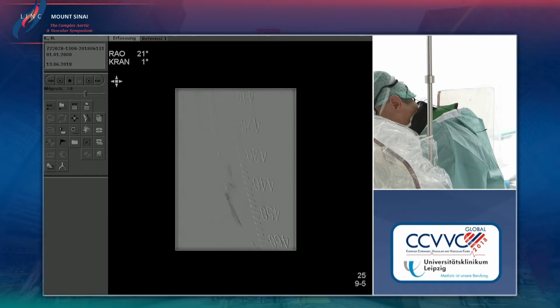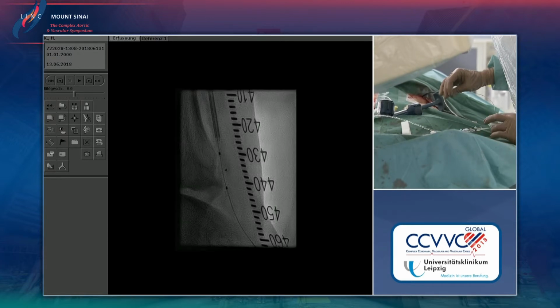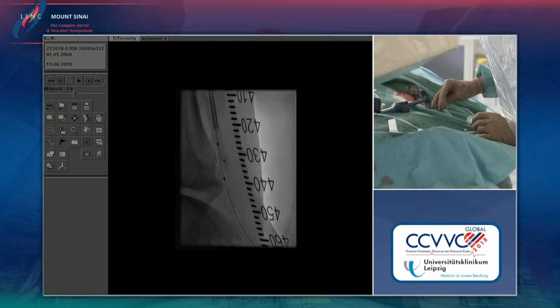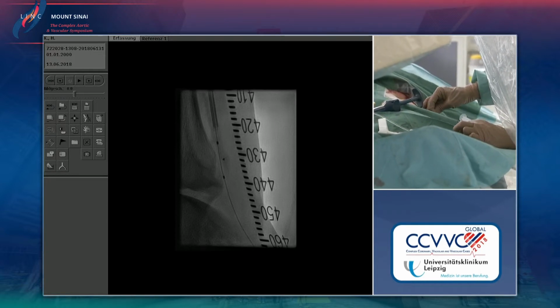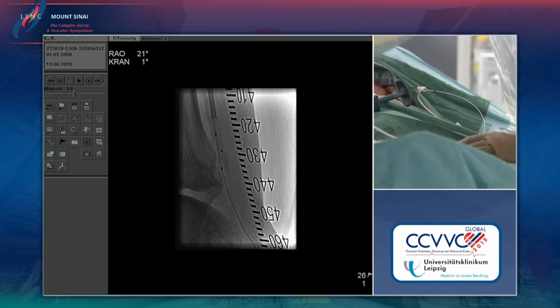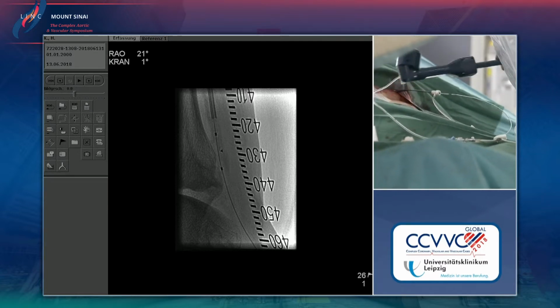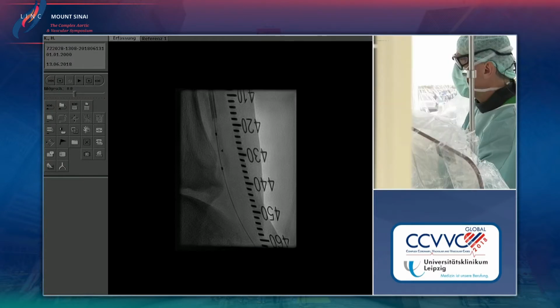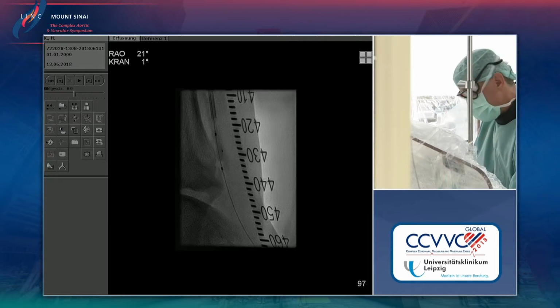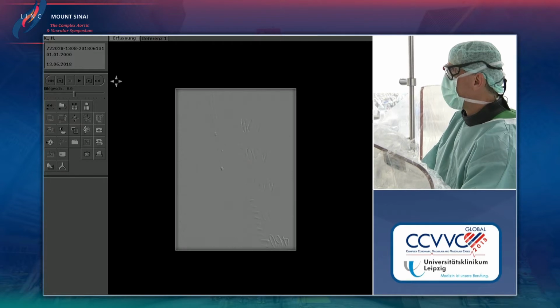Really just to deflate and turn it around a little bit? Sorry? Said probably deflation and then torquing the catheter a slight bit. Yeah, I can try to torque it. I can try to maybe go a little higher to see whether there's some area with less calcification, but I think there is even more calcium. You can only try once again here. This device will help non-surgeons understand how painful it is to do a distal anastomosis sometimes. Everywhere you put the needle, you hit a calcium.